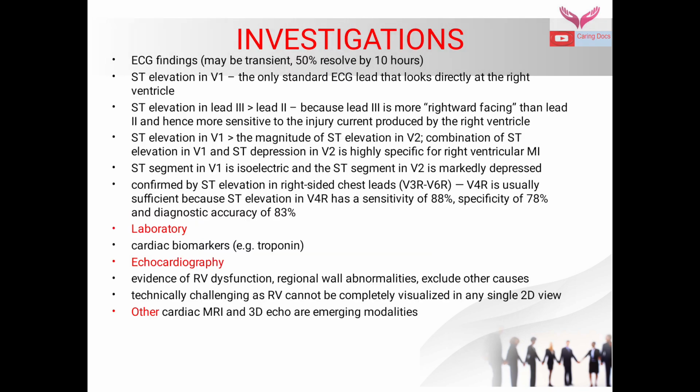Whenever the patient presents with RVMI, ECG findings may be transient, and in 50% of the cases they resolve within 10 hours. ST elevation in V1, the only standard ECG lead that looks directly at the right ventricle. ST elevation in lead 3 more than lead 2, because lead 3 is more rightward facing than lead 2 and hence more sensitive to injury current produced by the right ventricle. ST elevation in V1 more than the magnitude of ST elevation in V2. The combination of ST elevation in V1 and ST depression in V2 is highly specific for a right ventricular myocardial infarction.